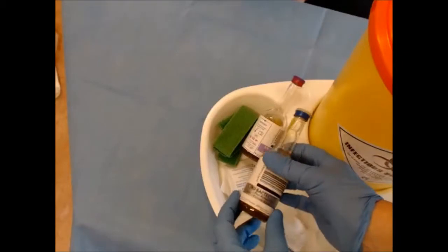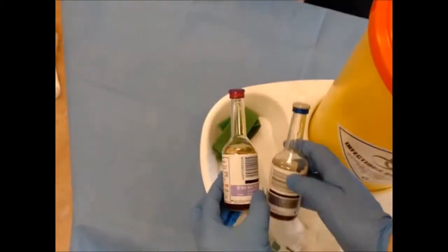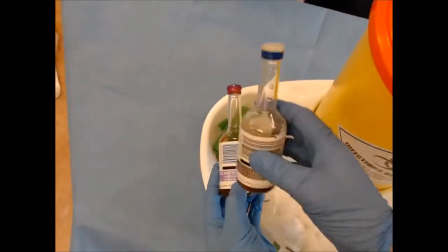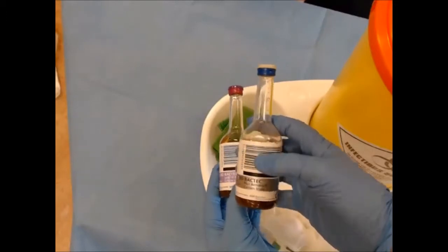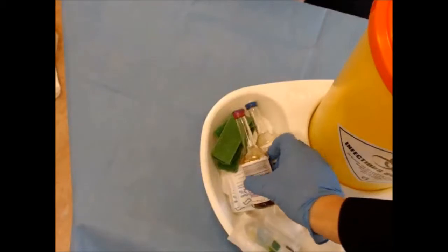And then you need your blood culture bottles. You need one for an aerobic sample and one for an anaerobic sample. They're labelled. You can see it here, which is which. You always fill the aerobic one first and they require 8 to 10 mils per bottle. And then you'll fill the anaerobic bottle second.